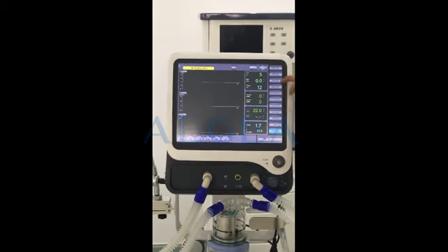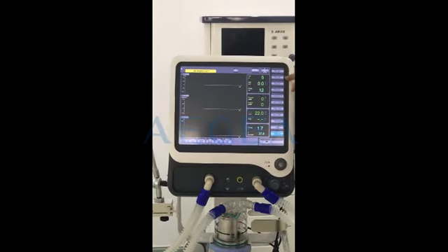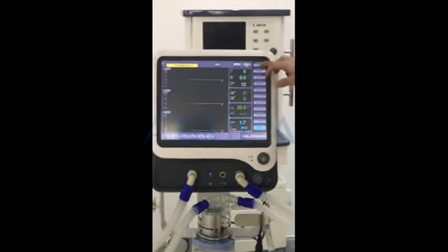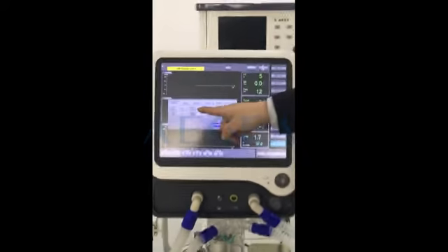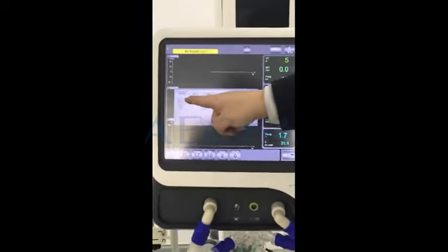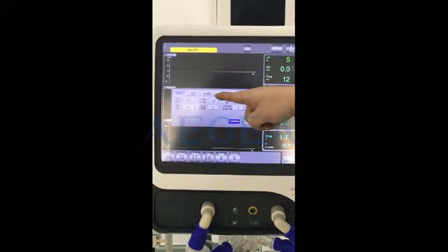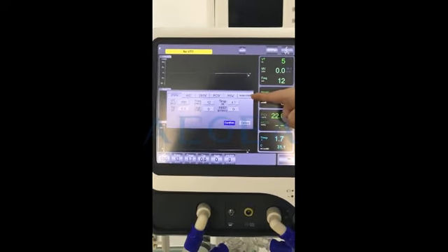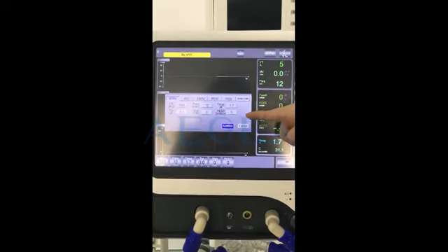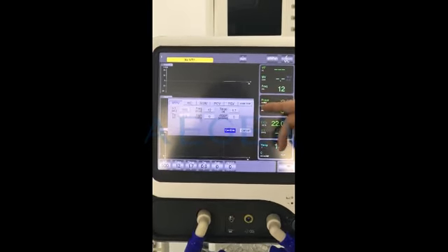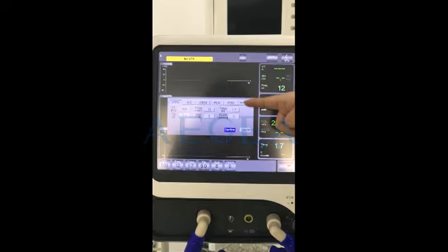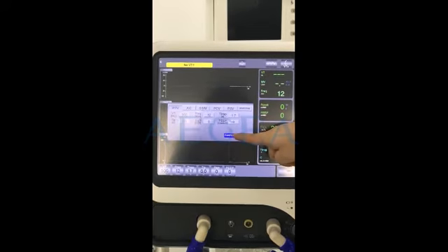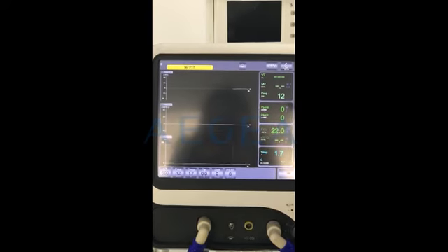Here we also have functions like parameter setting, including ventilation modes: IPPV, AC, SIMV, PCV, PSV, and spontaneous. And if you want APRV or PRVC, we can add those ventilation modes as well.